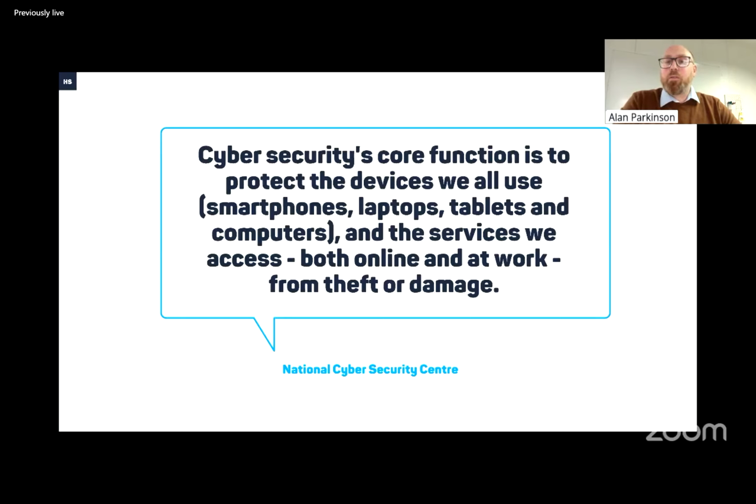In the medical device context, laptop or smartphone is replaced with your medical device. Could be SaMD, and then the services could be where they store data. So if you provide a lot of processing on the cloud, or it could be the patient data, where's the patient data storage, and then theft or damage. Most people will think of stealing patient information, but devices could be damaged, which then puts people's lives at risk. So that's one that's forgotten quite a bit.